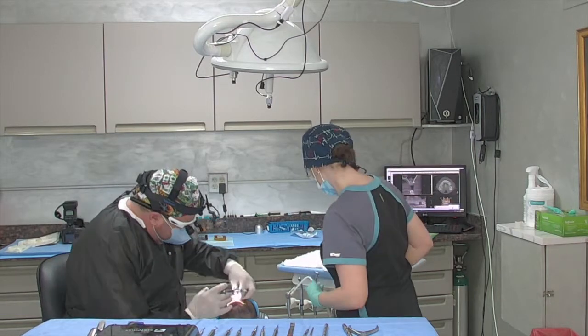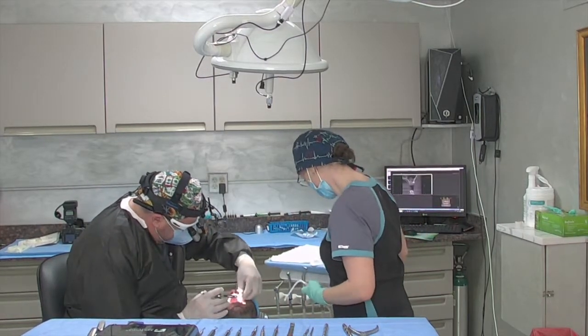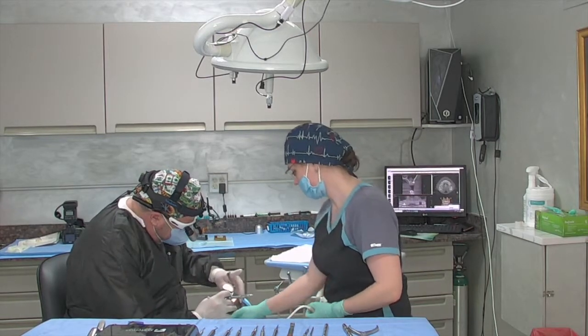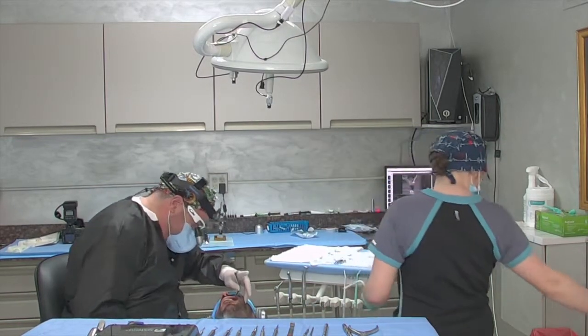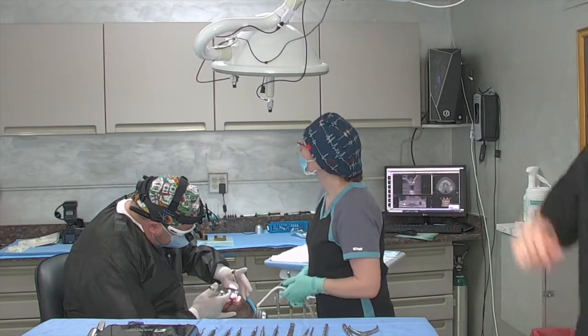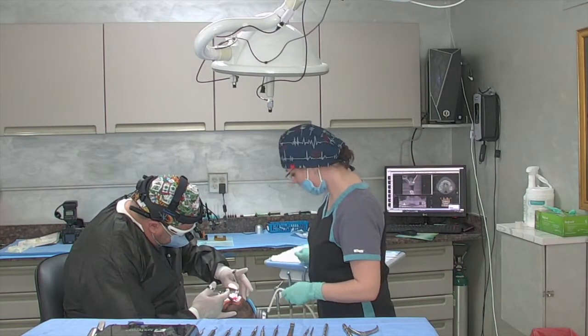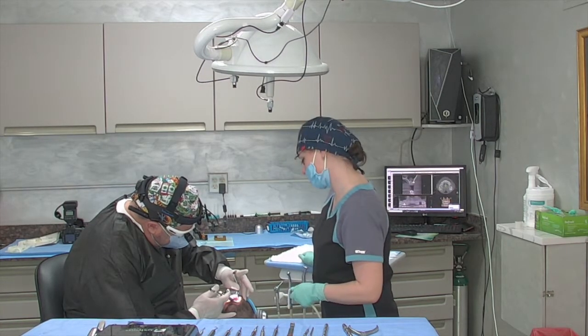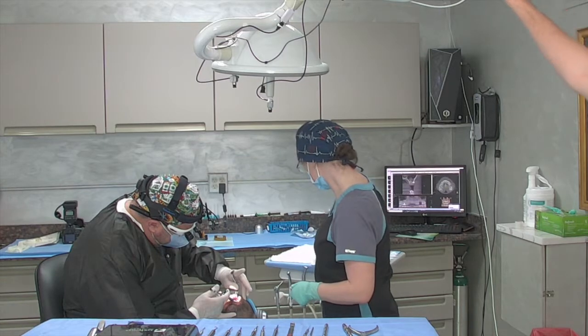Okay, Matt. A couple little pinches, okay? And we'll turn this way, Matt, all the way. Thank you, perfect. A couple little pinches, okay? And we'll just do some infiltration in the buccal vestibule. Once again, with Septocaine.